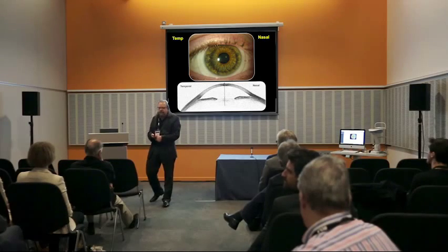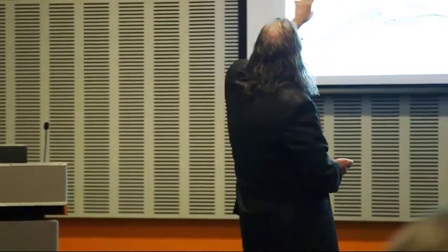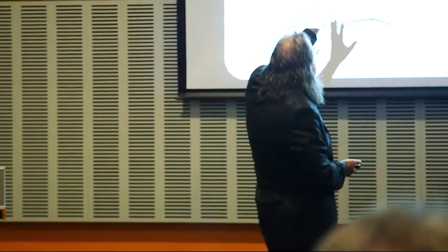Now, the things I take away from this asymmetry in the sclera is, number one, it has helped me so much to better understand why scleral lenses have this tendency to decenter, why they get pushed over to the temporal side and slightly down.